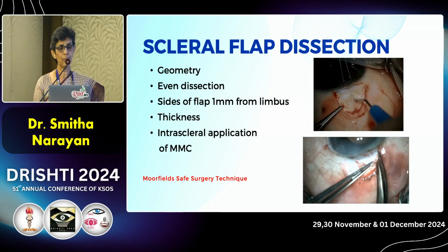And some of the people prefer to give an intrascleral application of mitomycin C. I used to do it, but I don't think that makes a big difference.